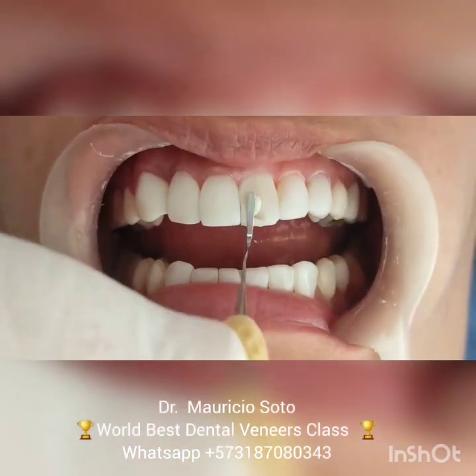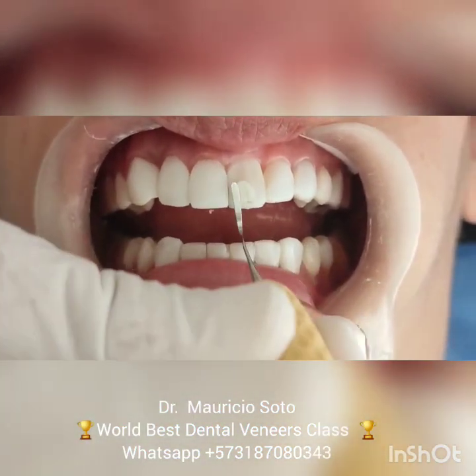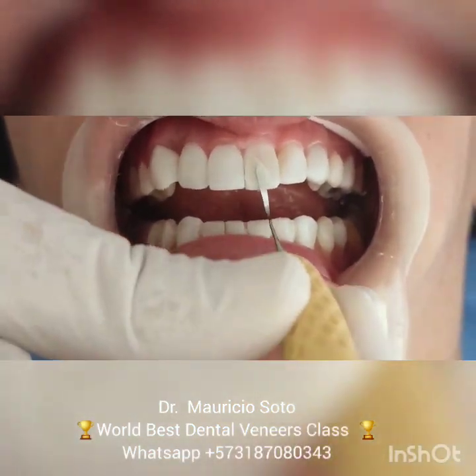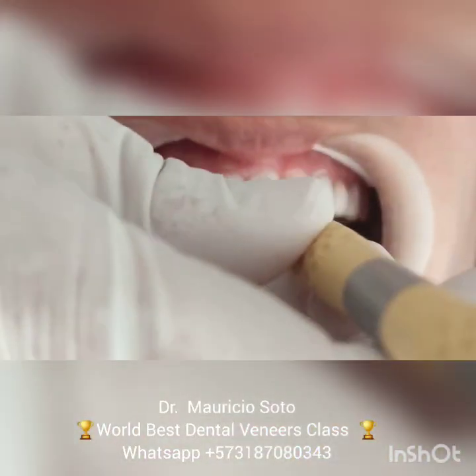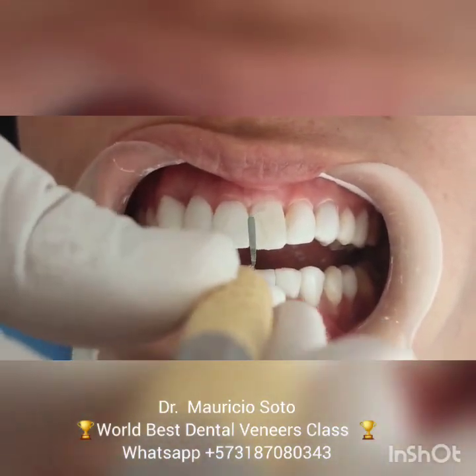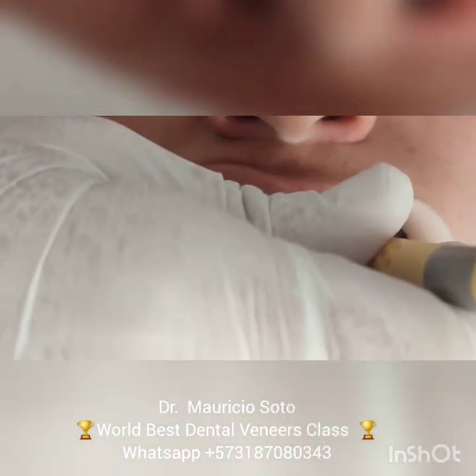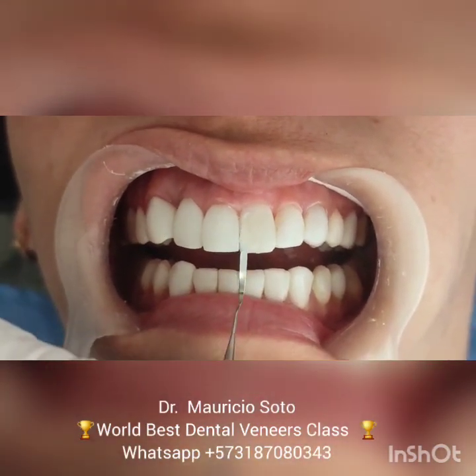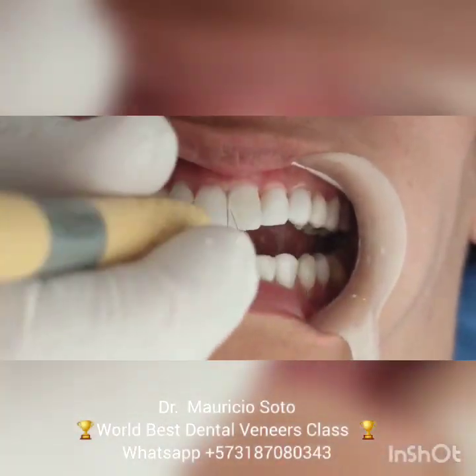After the bonding, we start with the application of the composite resin. Remember to use the same color that you used originally. For this reason, it's very, very important to take note — write down the color and the brand of your composite in the records of every patient. In this way, it's easy to find the right color and the right composite.